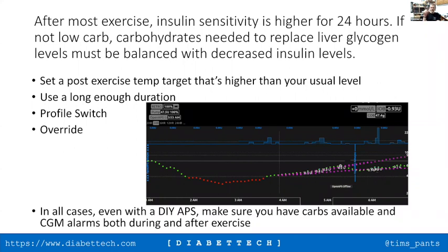If I'm stuck and I'm going for a ride and it's sudden, I haven't had that hour to get things set up, I'll probably have some extra food to buffer me through, in the knowledge that otherwise, with the IOB that I have on board, that normally would be fine, my muscles will take the glucose straight down.